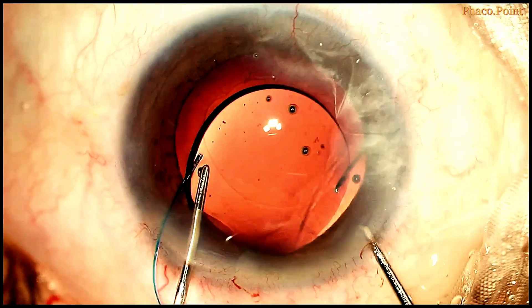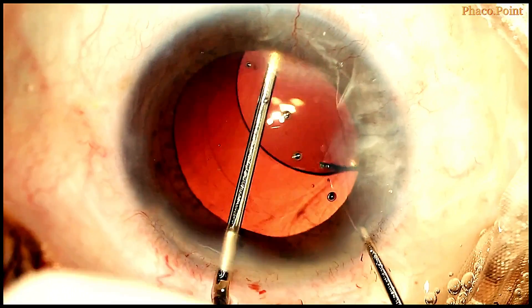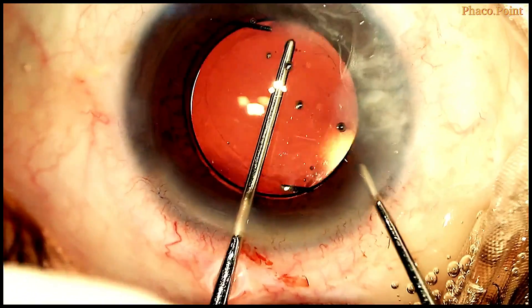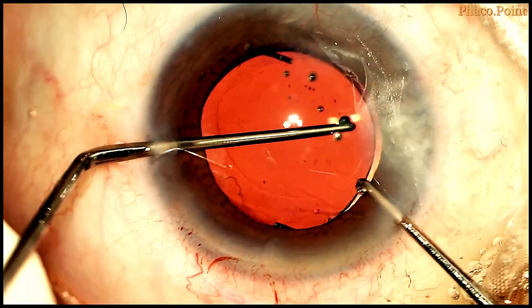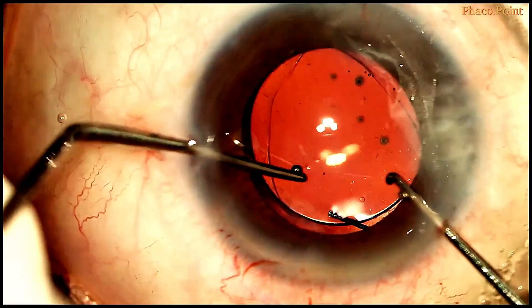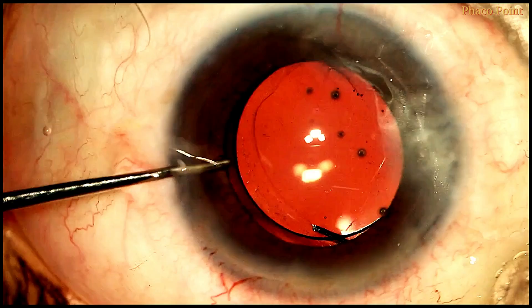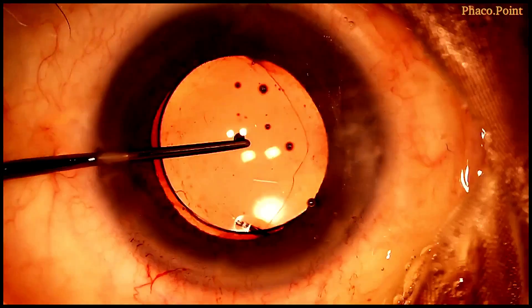A coagland hook hitched against the trailing optic-haptic junction easily rotates the IOL into the ciliary sulcus. After which, note how we perform a posterior optic capture — to do so, each edge of the optic is just dipped below the rhexis edge on either side.